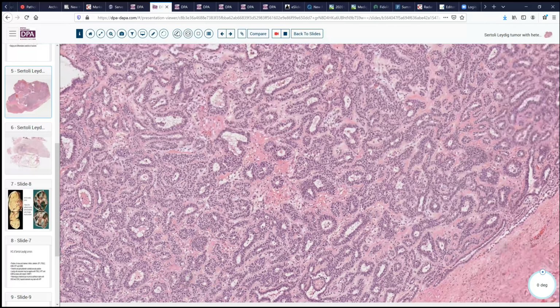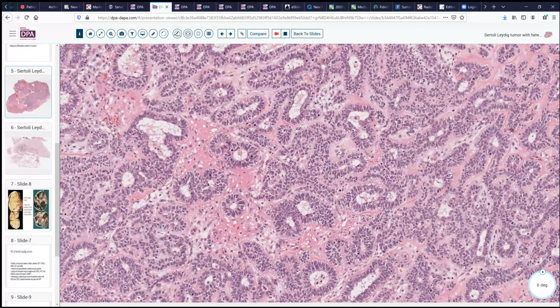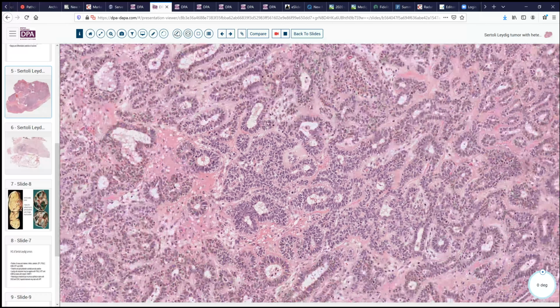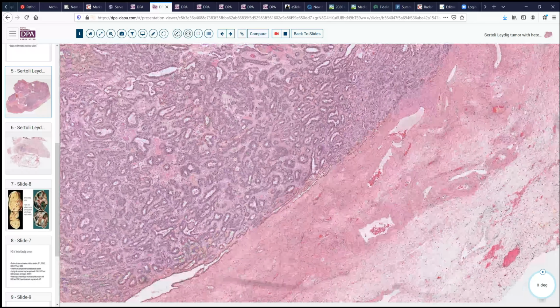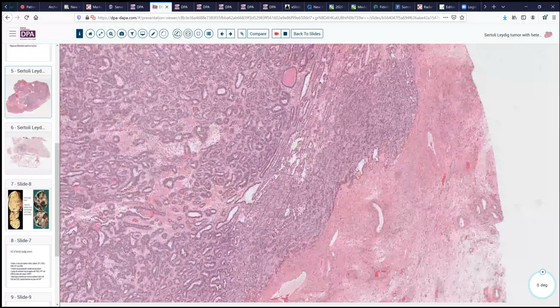And as is often the case, they can be quite focal, particularly as you get into tumors that are less well differentiated. And so extensive hunt may be warranted. Immunohistochemical stains may be necessary to help to document the presence of those Leydig cells.